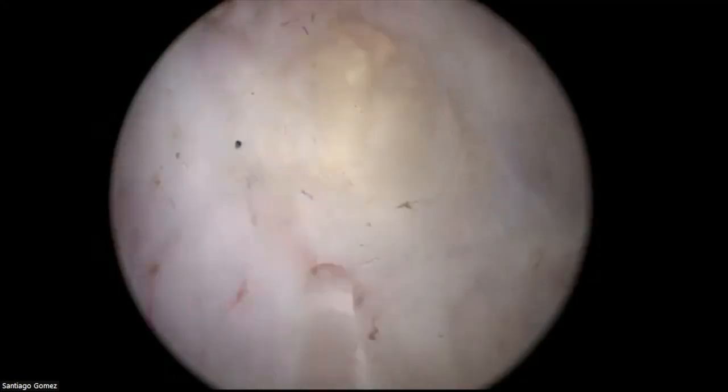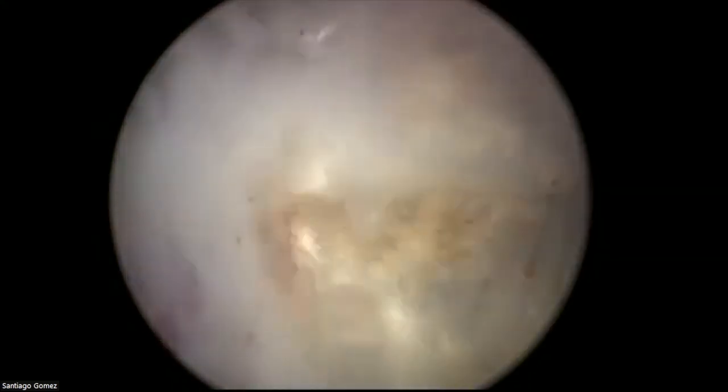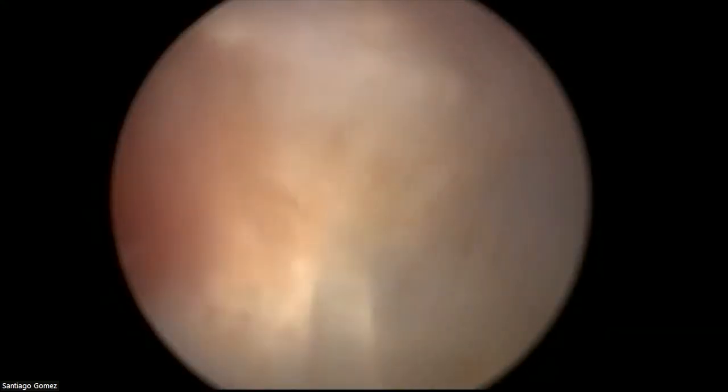Here, by the way, there is a nodule. You can see there is a small nodule. I'm going to try to take it out. You see, this is an adenomatous nodule. So I'm going to try to dissect it off the capsule.